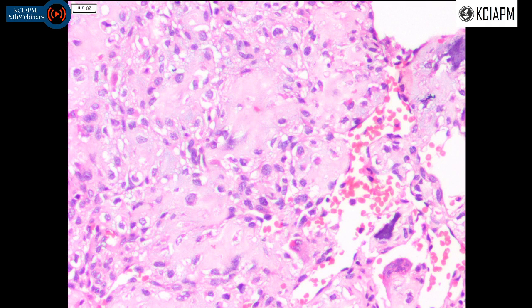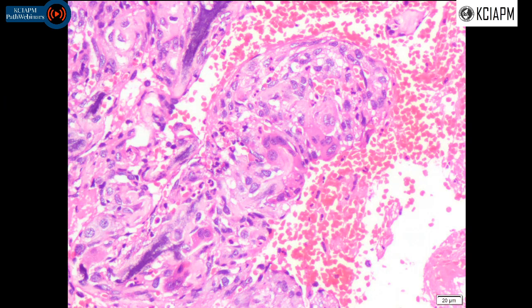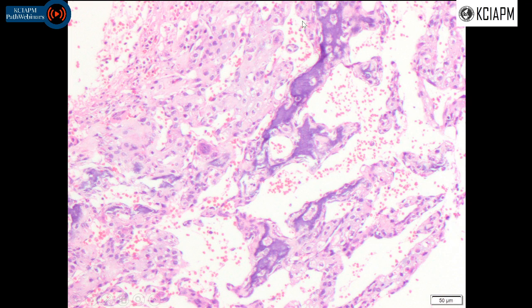But then, would this histology fit an aneurysmal bone cyst? There are many giant cells in addition. There is calcification, there is ossification happening, and you have spaces, you have this chondroid matrix. Here we have large areas of hemorrhage and the tumor with many giant cells. There is bone, small and large areas. And we have trabecular bone in these septae, which are traversed by these blood spaces. So you have cartilaginous or so-called matrix.